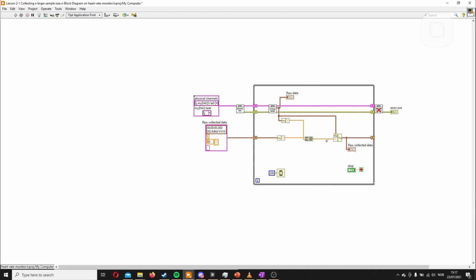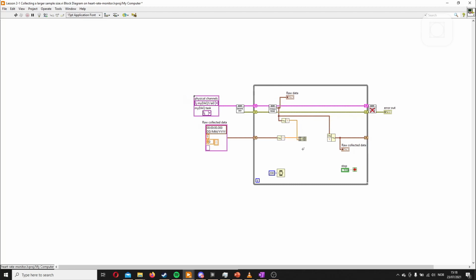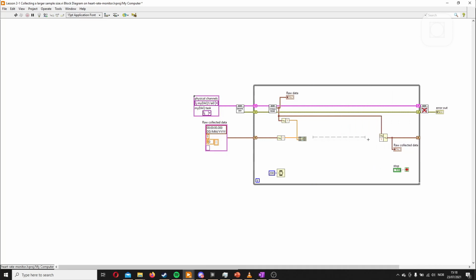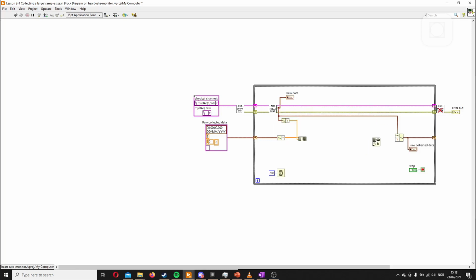So what we need is a way to cut it here, to snip it, so that if it's over this size, we make it shorter. What we'll do is make this a bit shorter here, like this. Let's create a little bit more space. We need to go into array, and we need the delete from array, because we want to delete everything we don't want from the array. So this is the one we want to delete from. We always want to start at 0 here, because we want to throw away the older signal, not the newer.